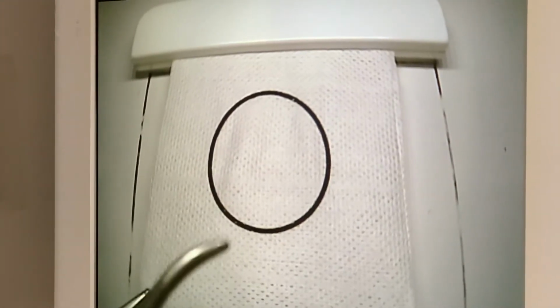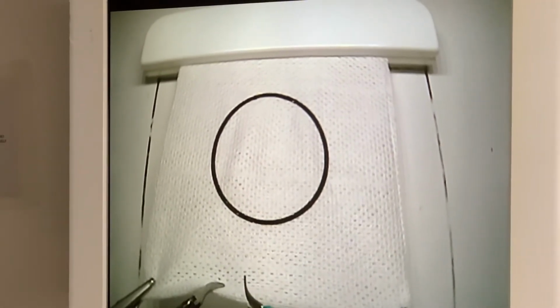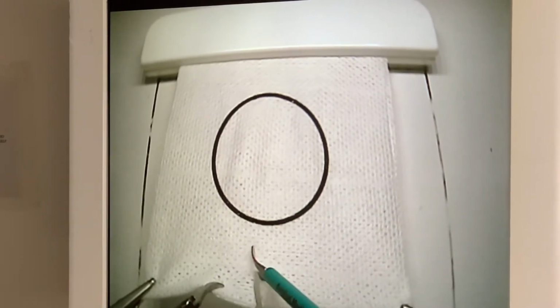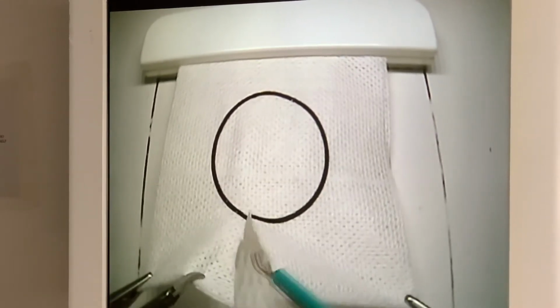Task 2, precision cutting. The goal of this task is to cut the circle out of the gauze pad. Using the dissector in one hand, you will hold the gauze, providing traction. With the other hand, you will use the scissors to cut into the gauze and then around the pre-marked circle carefully and completely removing it from the pad.